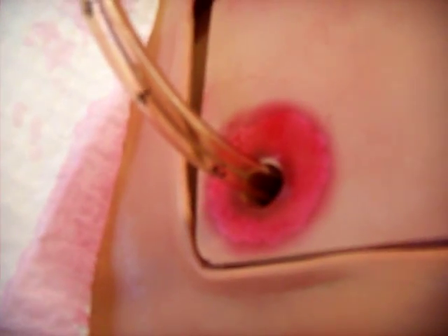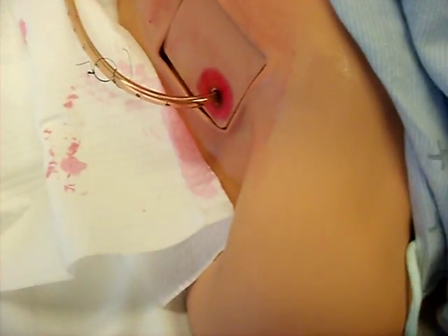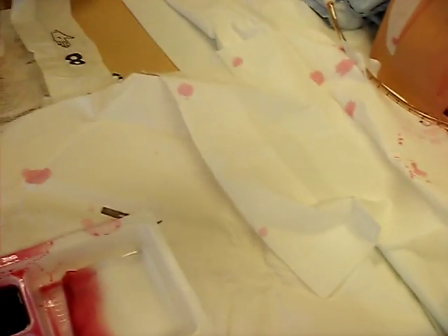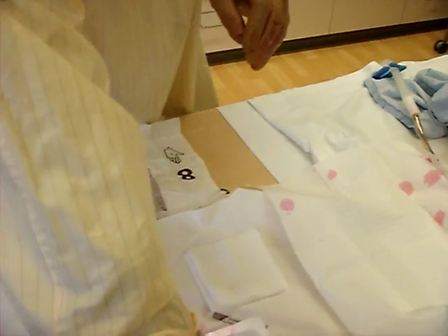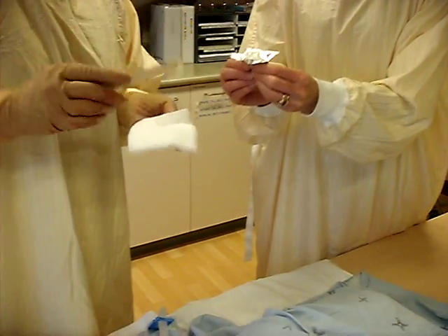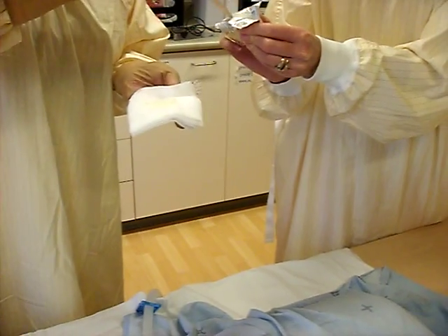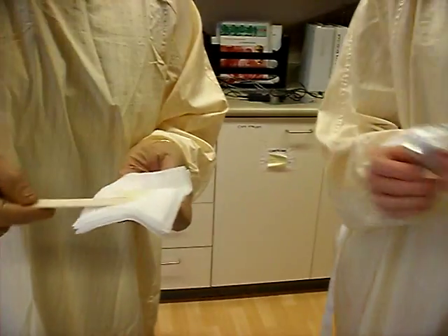Okay, Mr. Jones, we've reviewed how your breathing is going to go, so I'm just about ready to pull the tube. What's going to happen now is we're going to need to have gauze to put on the tube that has a measure of sterile Vaseline. My assistant over here is maintaining the sterility of the Vaseline package. We're going to get enough of it on there and spread it along the gauze dressing so that we can make sure that the entranceway to the chest tube will be well covered with the Vaseline.